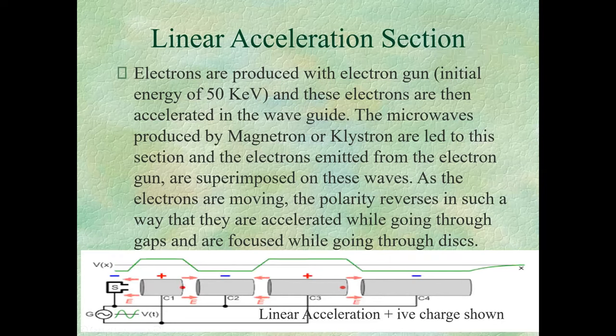Because X-ray is not mono-energetic, it has a whole spectrum. So we cannot call the whole spectrum MeV. We call it MV because it's heterogeneous, and it is designated by megavolt as if the beam is produced by applying the voltage across an X-ray tube.